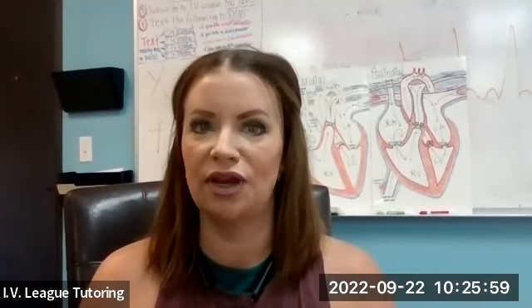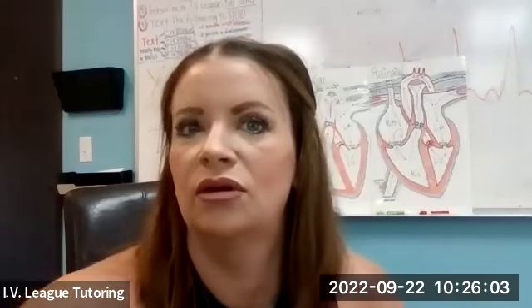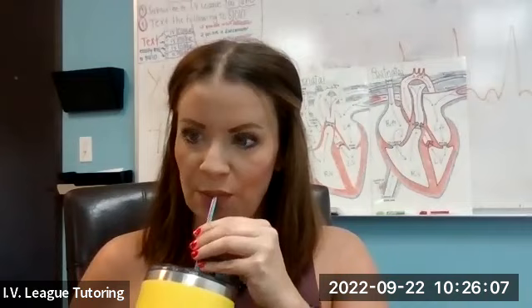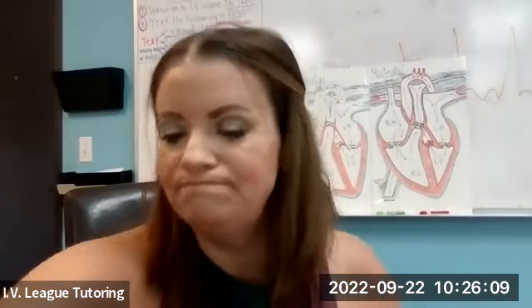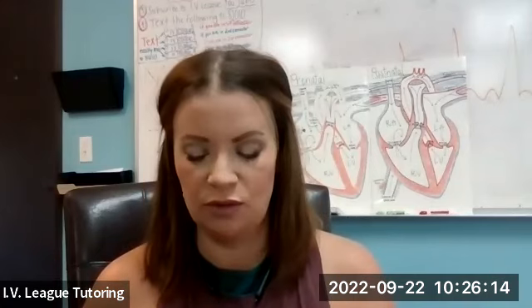Okay. Is it regular? You want to look and see if it's a regular or an irregular rhythm. What do I mean by this? Look at the QRS complexes. You can also listen. All right, so is it regular or irregular? Y'all need to know that for every dysrhythmia, and we'll talk about that.